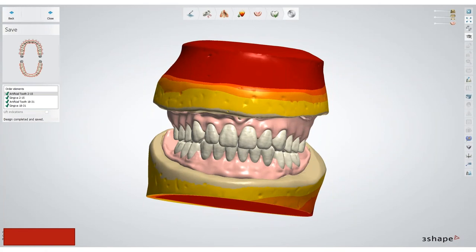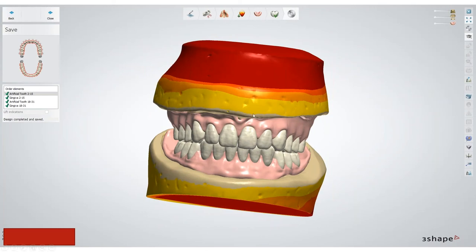Once the case is scanned in, her setup is done digitally. I don't necessarily go all the way through to fabricate a printed or milled prosthesis, but from the setup standpoint it works very well — I can do a lot of corrections. For this particular case we're using Vita Vigo teeth. The way Vigo teeth are designed, they're shorter and have no undercuts, making them optimal for bonding directly to the base plate that's either printed or milled. The teeth are pre-made, so you can't really adjust them digitally per se, but there are some ways around it.